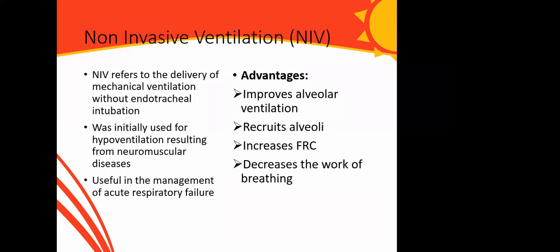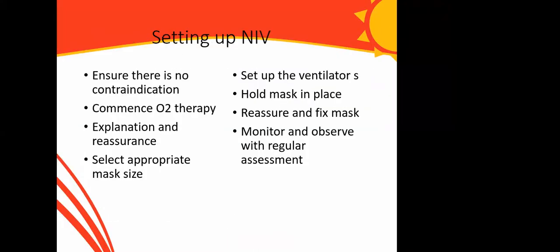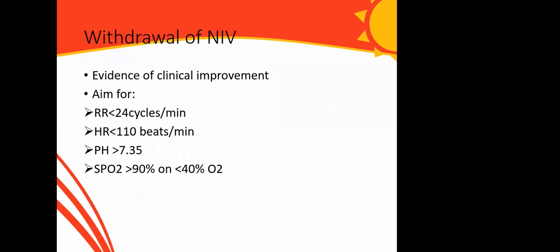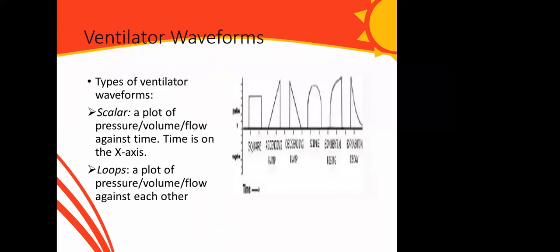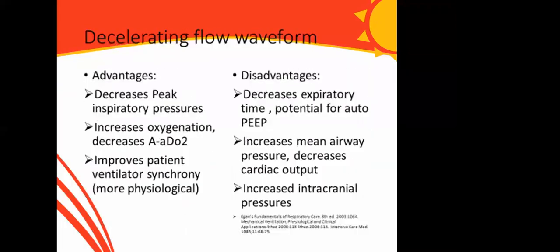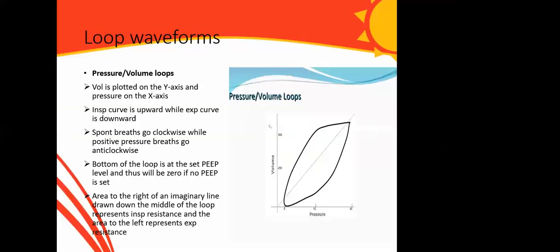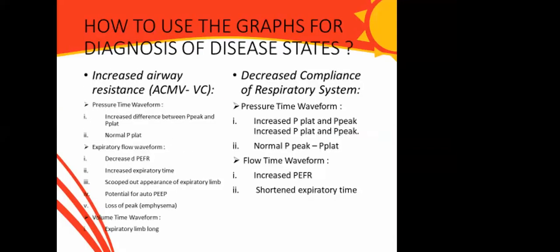All right, I'm not going to go into non-invasive ventilation today. Let me see. Oh, ventilator waveforms. This is important because from your ventilator waveforms, you may be able to troubleshoot your ventilator. Now, how to use graphs for diagnosis of disease states.